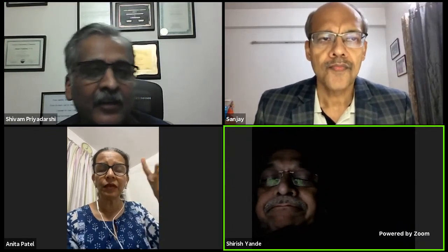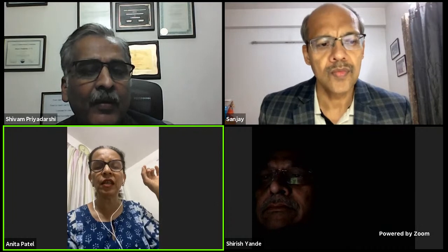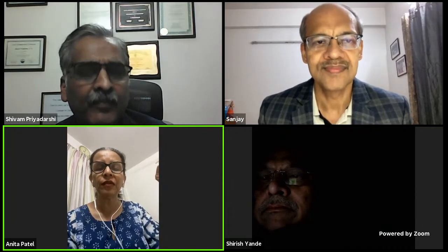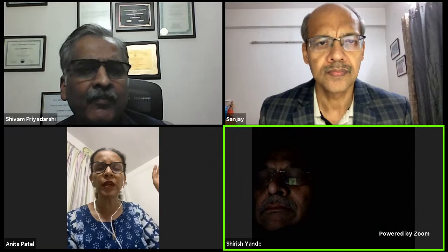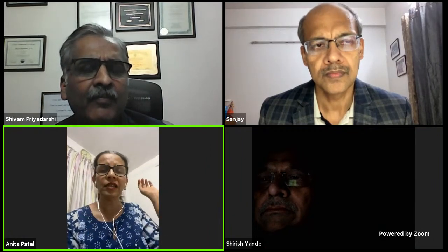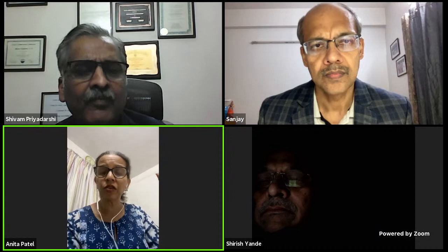And the other thing that we also do sometimes is we don't have to have superimposed images of the MCU on the UDS screen. Even if you have facility of doing a simultaneous cystogram, the two images don't have to be superimposed, as long as somebody is handling the X-ray C-arm and there is a UDS going on simultaneously, as long as the images are correlated with the trace, I think that is all that you need.